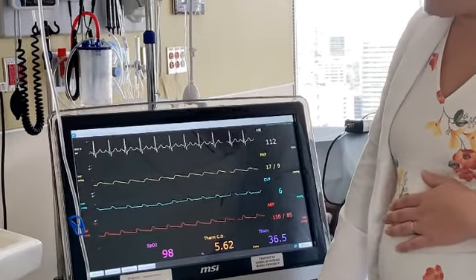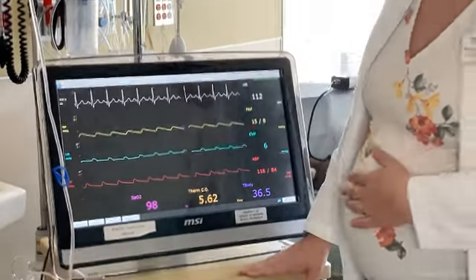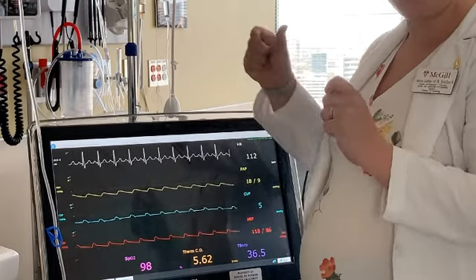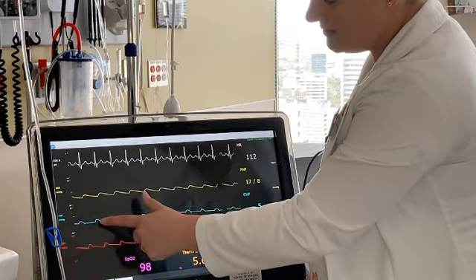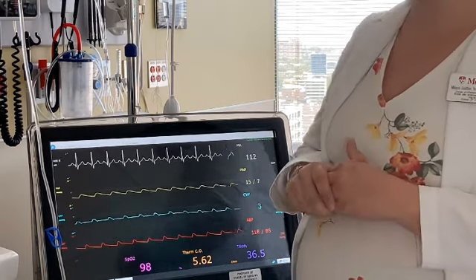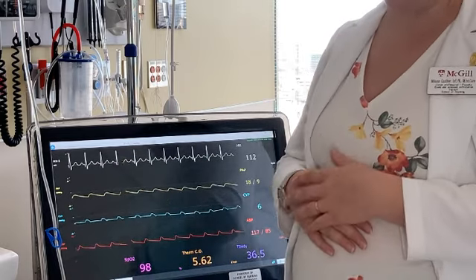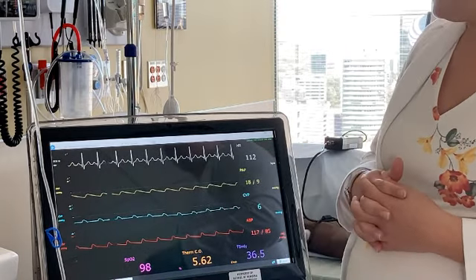And you also want to be measuring it essentially in line with your QRS complex. There is a way on our monitors in hospital to actually get lines on the monitor as we play with the buttons, lines that align along the QRS complex and across the central venous. The intersection of those two lines is essentially our measured central venous pressure. And we're taking the QRS complex that's right at the end of exhalation so that we don't have intrapulmonary pressures affecting our central venous pressure.